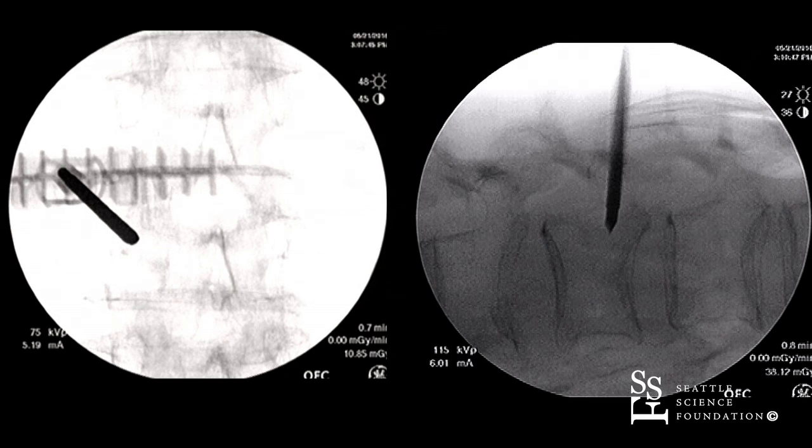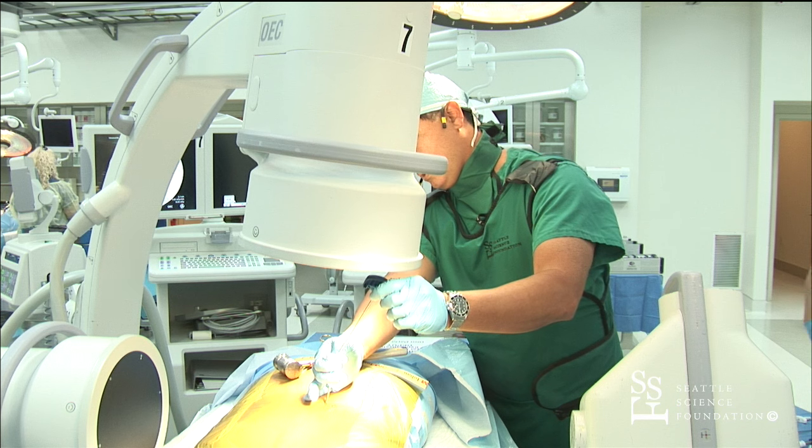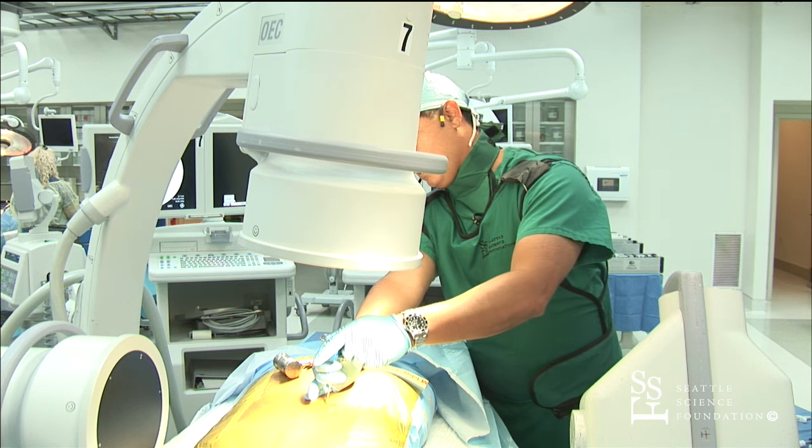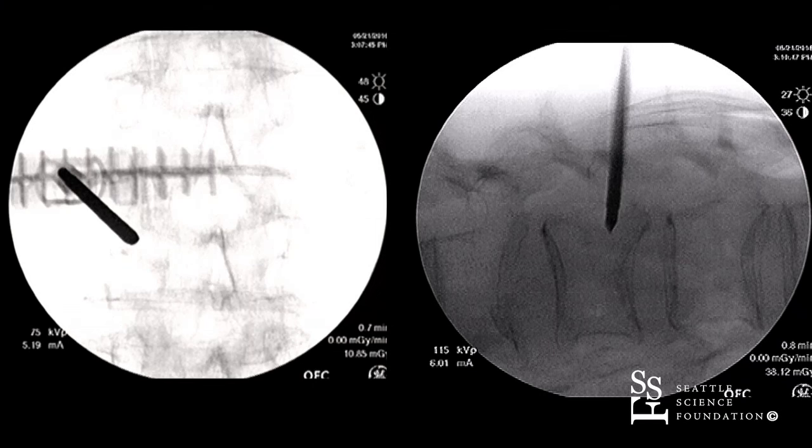At this point, you might want to change over to a bevel tip to get more of an inferior trajectory, allowing the introducer to dive more inferiorly.